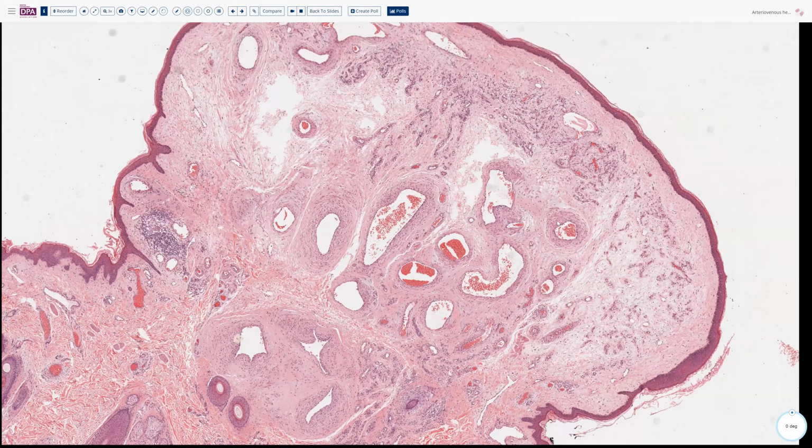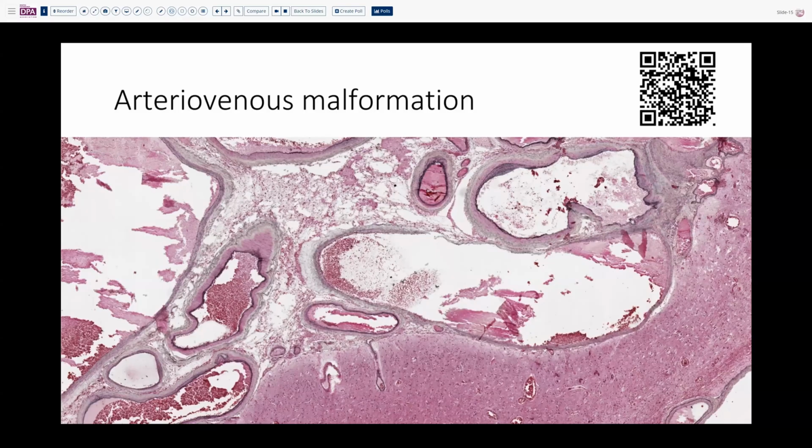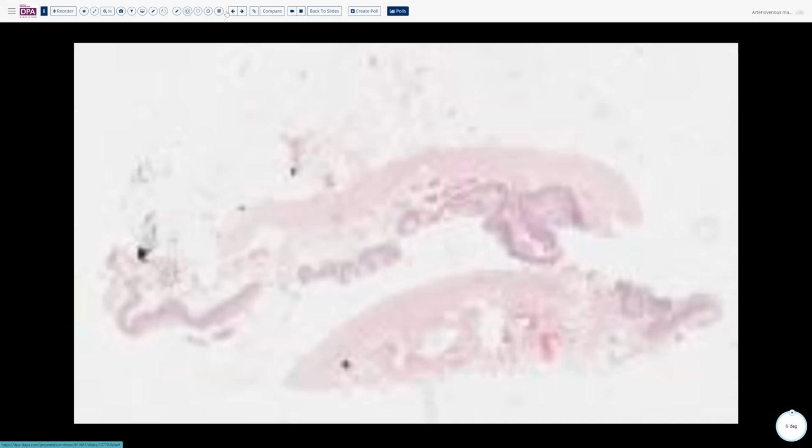All right, arteriovenous malformation. I think we've touched on this lesion just a little bit. Let's cover some more here. This is a lesion where we do have a true arteriolar component. And that's why I've given you an elastic tissue stain, to highlight that elastica can be present in many of the vessels, not all. So you see some here, but not here. See some here, but not over here. That's to indicate that these are lesions that have a combination of arterioles and venous elements.